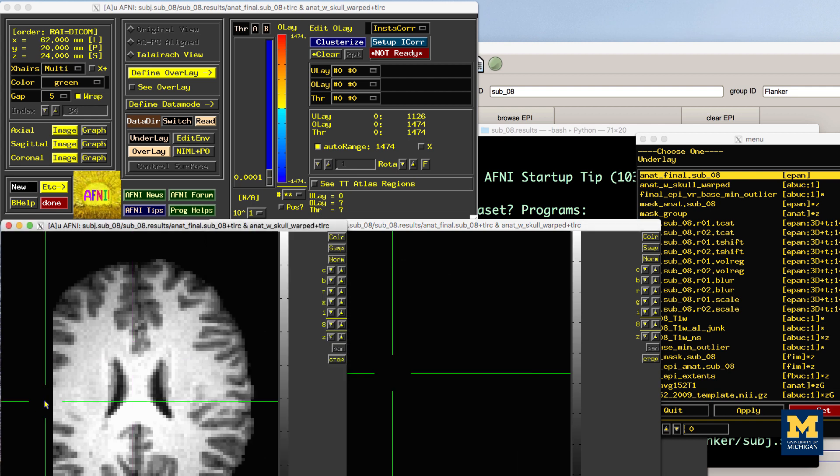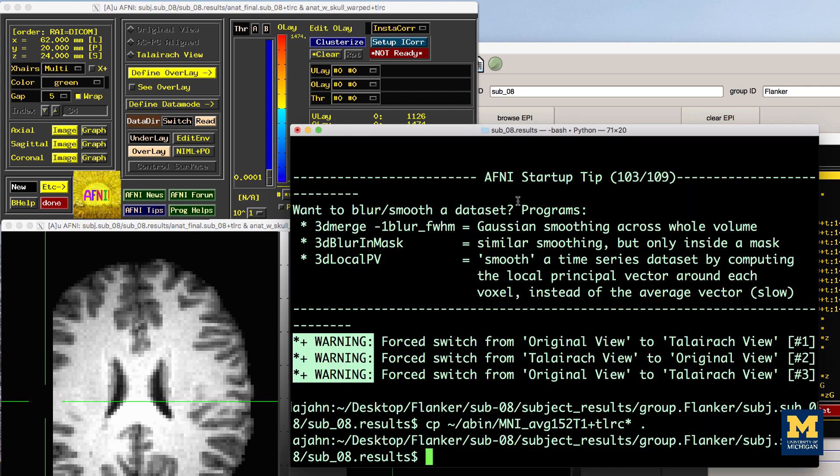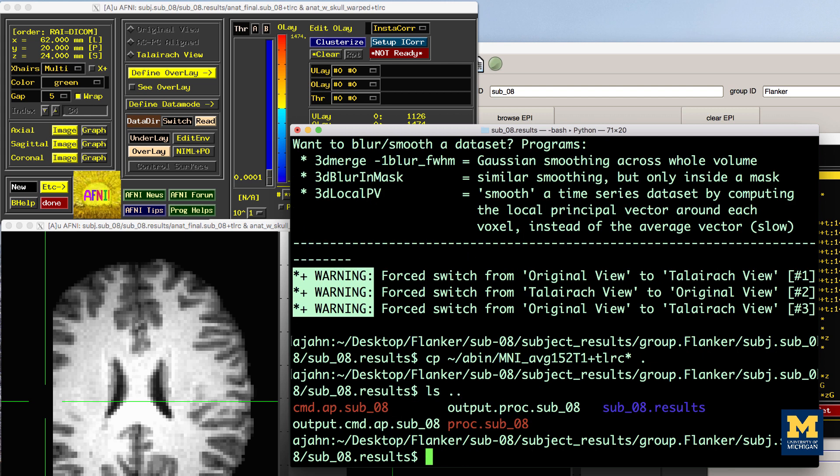When you detect an error in the preprocessed images, you should examine the output of your preprocessing script. If you started the script from the ubersubject.py GUI, the output will be printed to the preprocessing command window. A copy of the text will also be stored in a file called output.proc, followed by the name of the subject ID, which is located one directory above the preprocessed data.